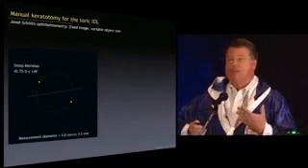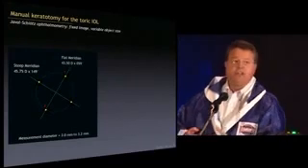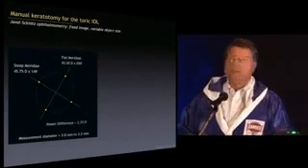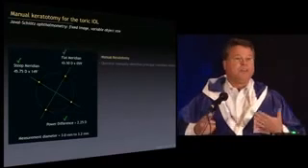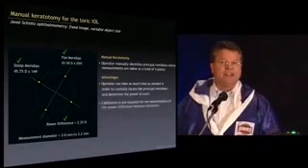So why does a manual keratometer work so well? And this is what the manufacturer recommends. Well, if you're off on your axis, you actually get a picture, and you get told that you're in the wrong place. When you're in the right place, you get a good picture. And so here's the steep axis, or steep meridian, and the flat meridian, and what we're looking to do is just tell the power difference between them to give us what we need for the toric IOL. So with a manual keratometer, you're only measuring 4 places, but it turns out that they're the right 4 places, and it's the right information.